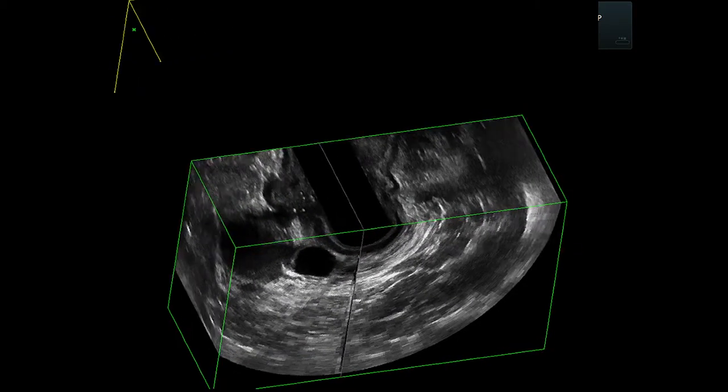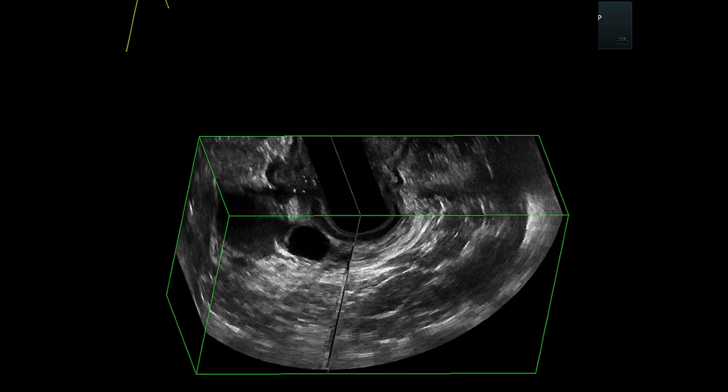So this is just a demonstration of how you see the image with this kind of procedure, I think really of a high quality, high resolution. And we can again define that there are two lesions. One is a cystic lesion. The second one is a solid lesion at the level of the puborectalis muscle between 6 and 8 o'clock position. That's it. That's all. Many thanks.